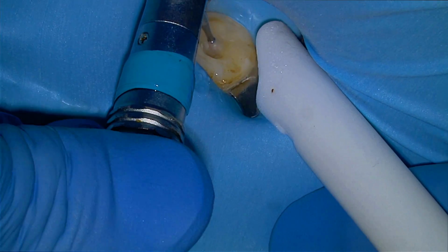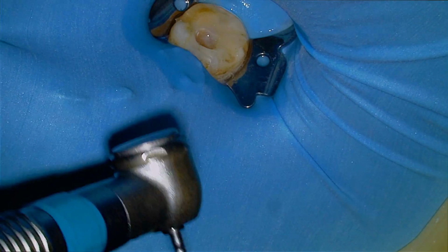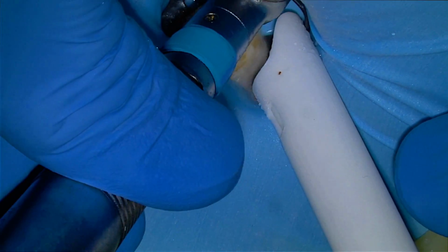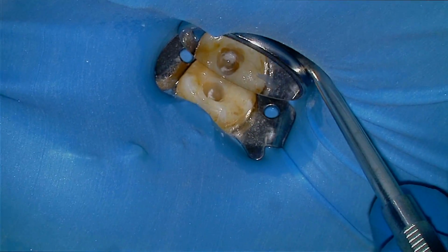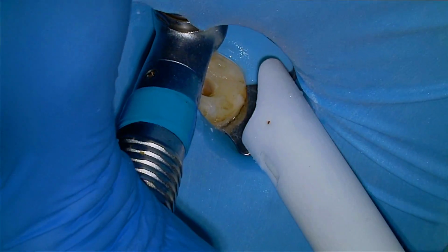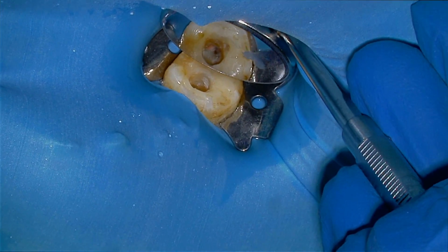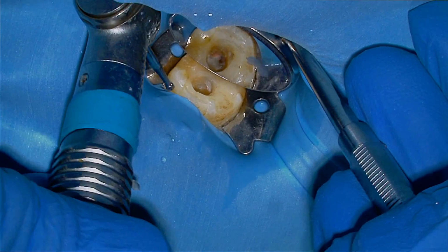And unfortunately, the patient can't open that wide. So using my surgical length burr won't work. So I elected for just a shorter burr, didn't matter what it was. We just used this shorter diamond. And now we're getting close. And I know that the length of my shank that I'm looking for is 6 millimeters. So I'm going to go back in.